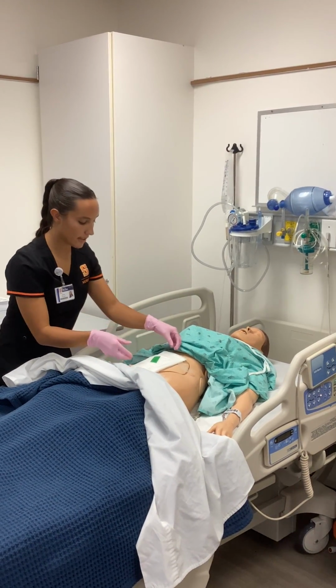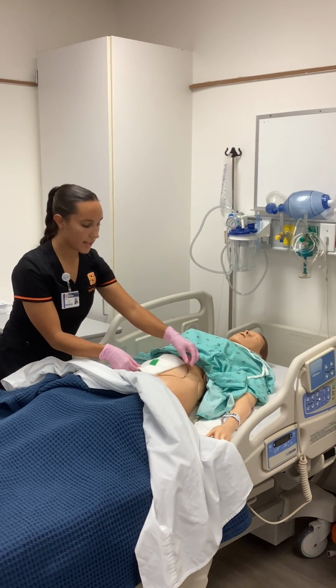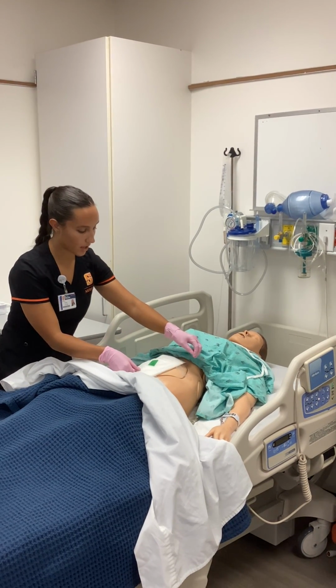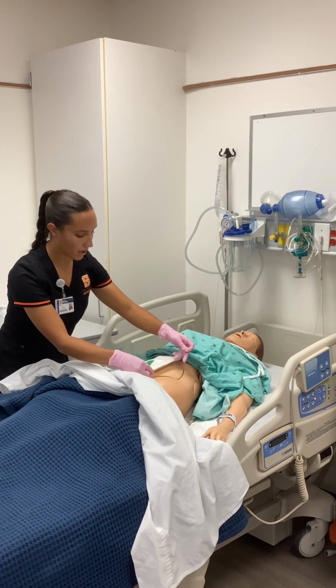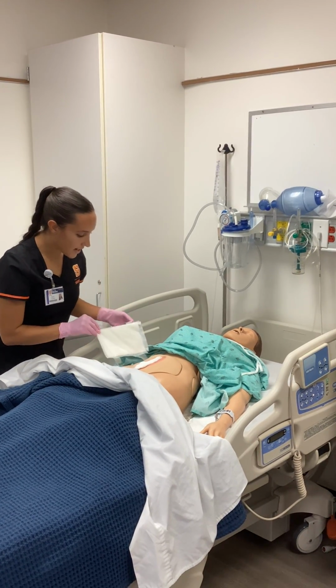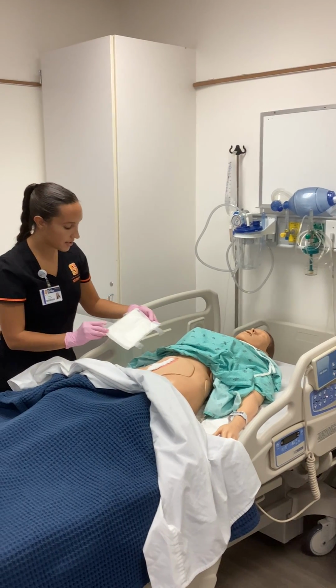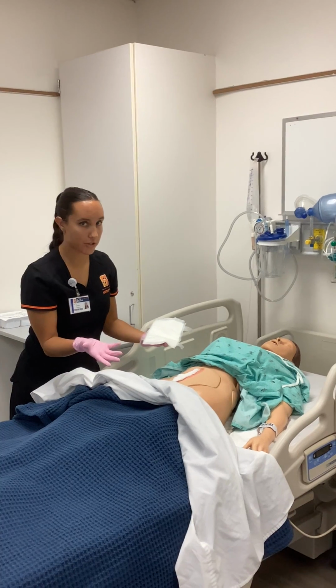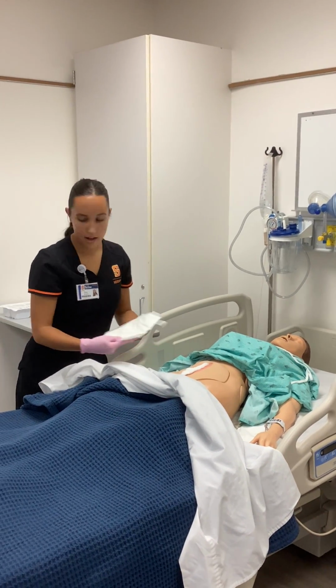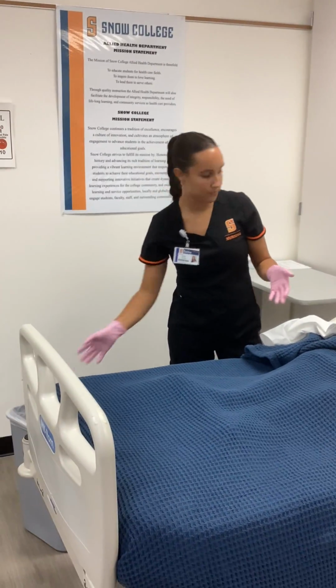Okay, so now I'm going to take the bandage off and take a look at it. They had mentioned in the chart that there was serosanguinous drainage, so we just want to make sure of what that's looking like. It doesn't look like there's any serosanguinous drainage, but we want to continue to monitor that in case there was. And I'm just going to throw this away.